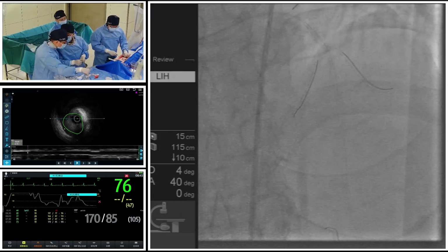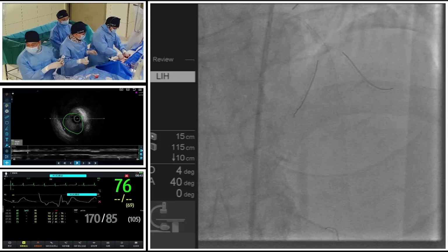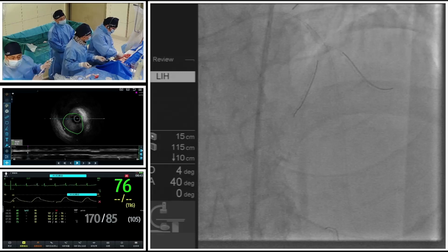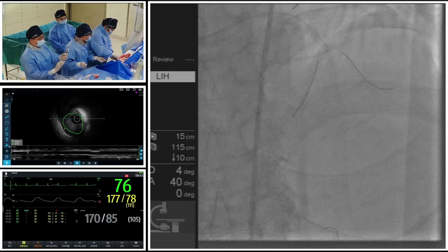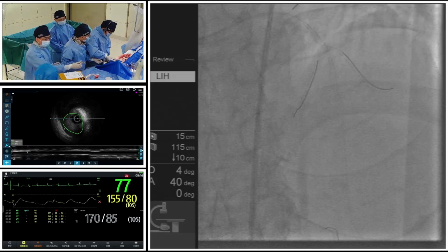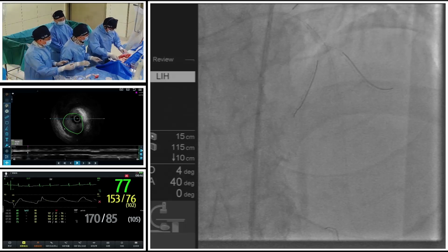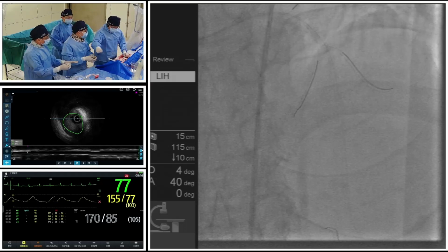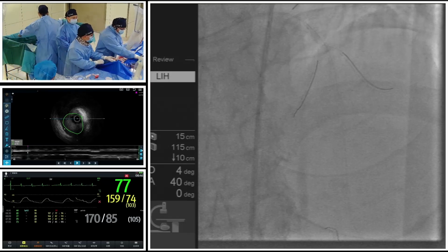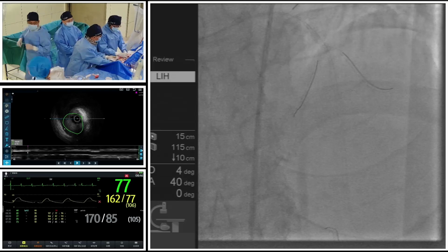So active rotablation can reduce the risk of potential dissections and hematomas, which gives us time and energy to treat the distal calcified lesion and also the bifurcation site. So I think that active rotablation first in this case is a good choice. It can avoid some potential complications.